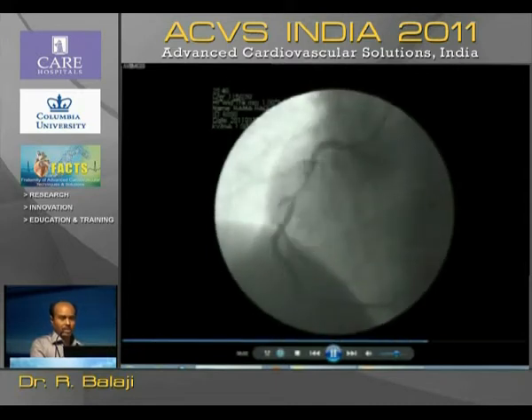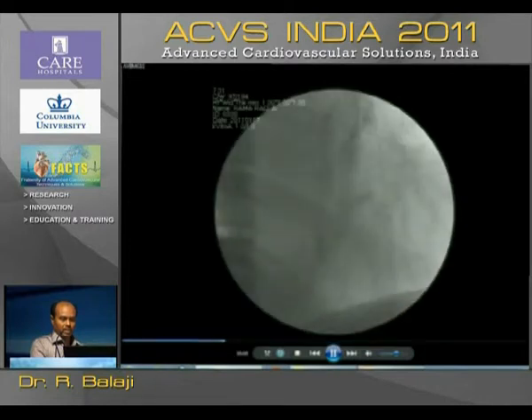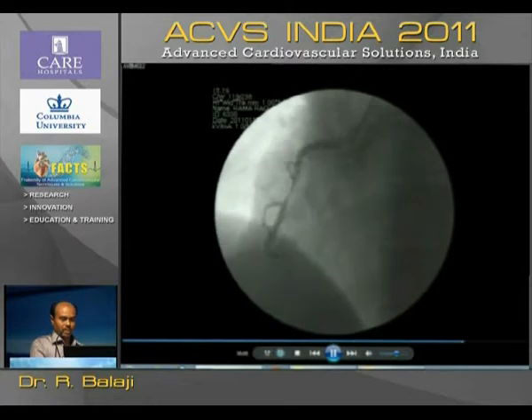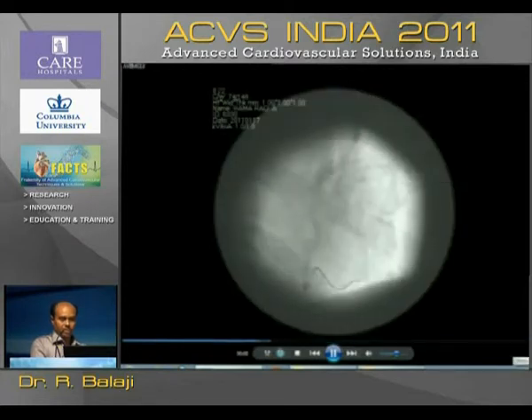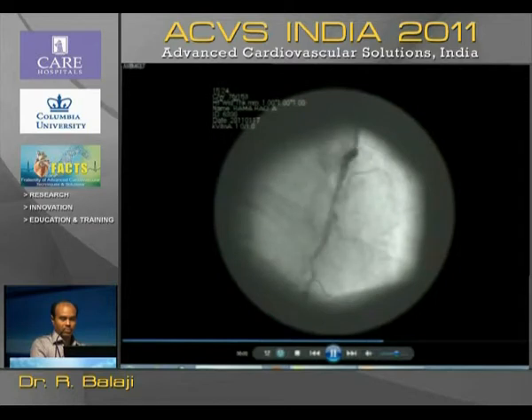right coronary artery. We promptly took a JR guiding catheter and a BMW guide wire, and then I wanted to dilate it with a 2 into 13 mm balloon at around 8 atmospheres. We got a good result, and then we wanted to stent with a 4 into 19 mm bare metal stent, which was deployed at around 12 atmospheres.